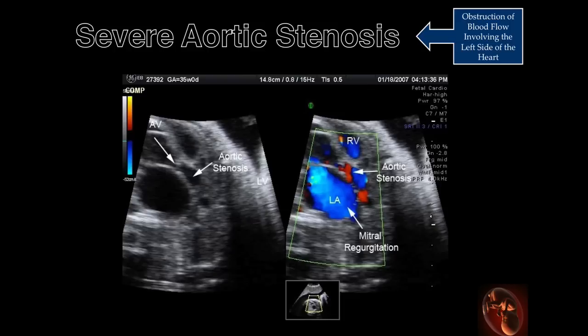Color Doppler demonstrates abnormal flow with aliasing distal to the aortic valve and significant mitral regurgitation as a result of increased pressure resulting from aortic stenosis.